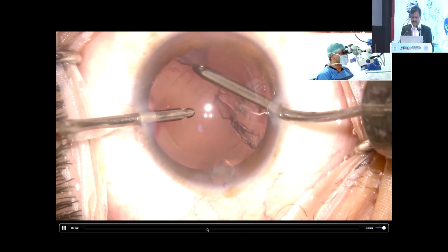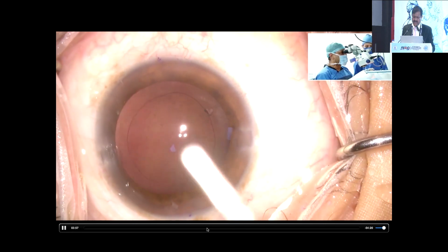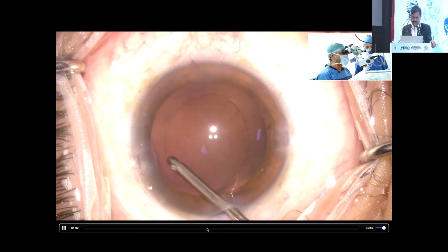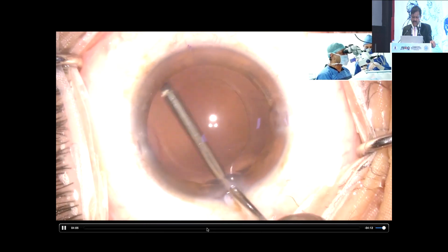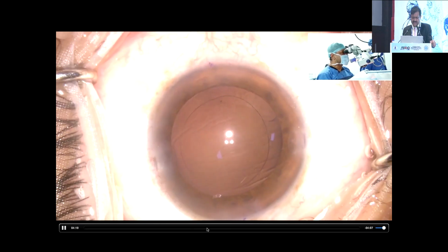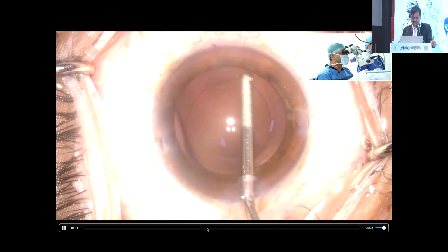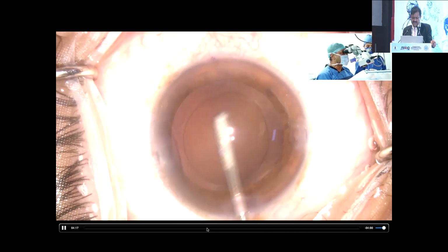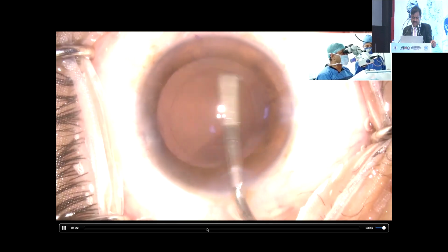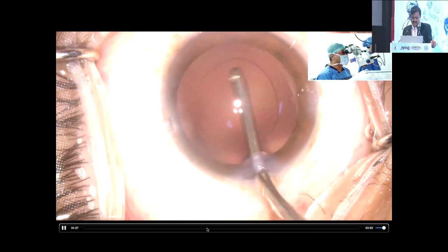The sandblasted system on this also helps me to simultaneously polish the posterior capsule and the under surface of the anterior capsule in most of these patients. So a quick jet of BSS can actually help in removing those lens fibers on the posterior capsule, and most of the time I would use this sandblasted instrument, which has a flow on the top, to just snugly sit on the posterior capsule and do away with the lens fibers, and just make this surface so shiny that there is hardly any scope of PCO.